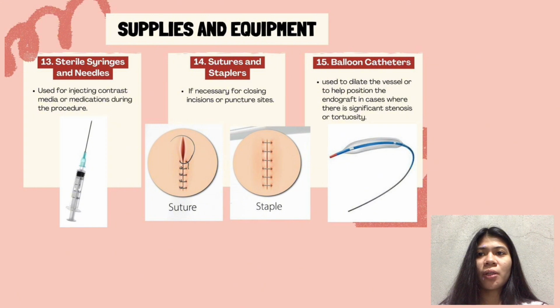Sutures and staplers. These are used to close cuts or puncture sites after a procedure. For example, after surgery, doctors stitch the skin back together or use staples to close the wound.